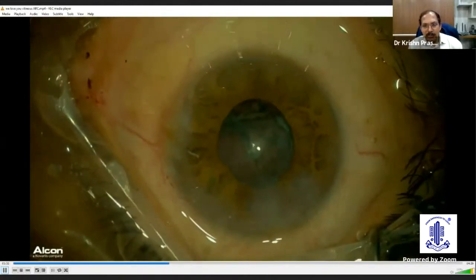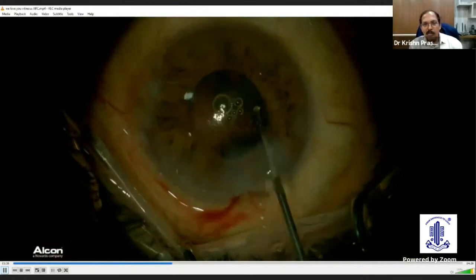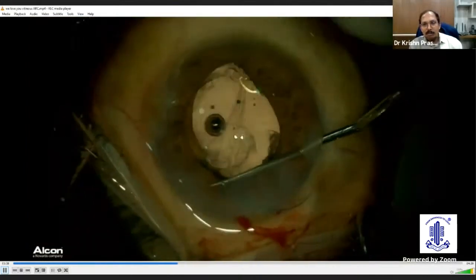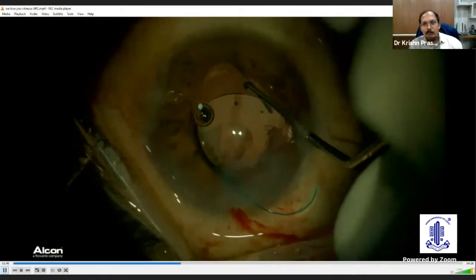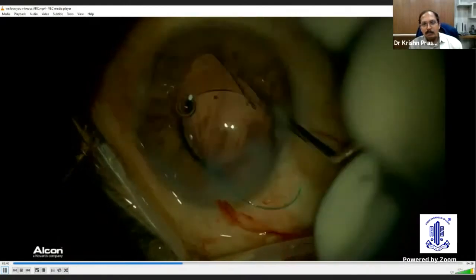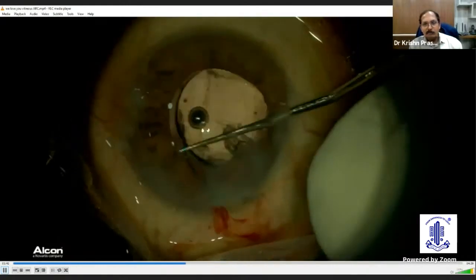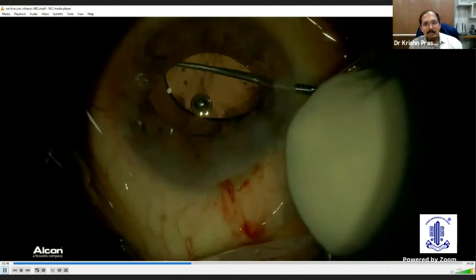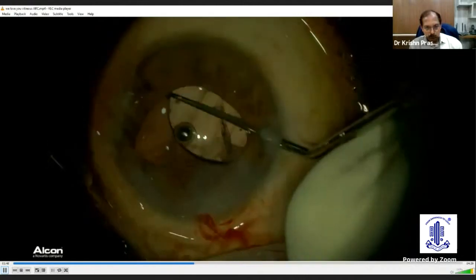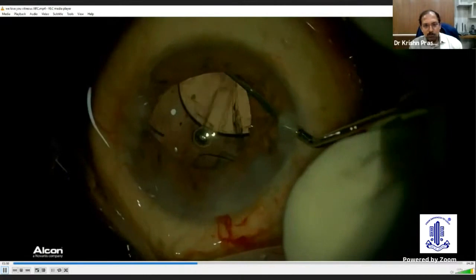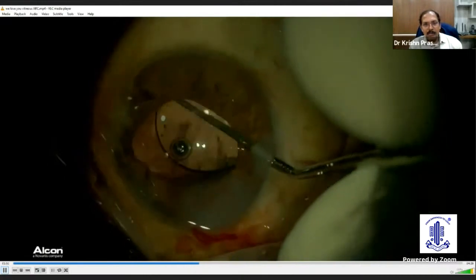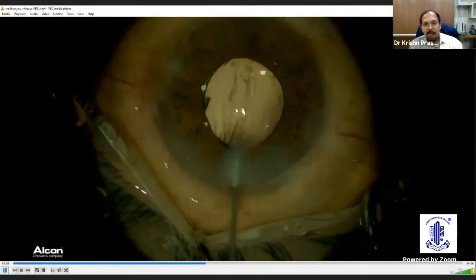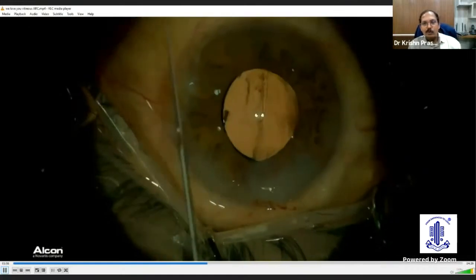He does that again to create another platform to lift up the remaining nucleus. He then has to do an automated vitrectomy. The intact capsule support from the rhexis helps him to place the three-piece lens in the sulcus and then an out-of-the-bag placement. An intact vitreous face has helped to create a scaffold.